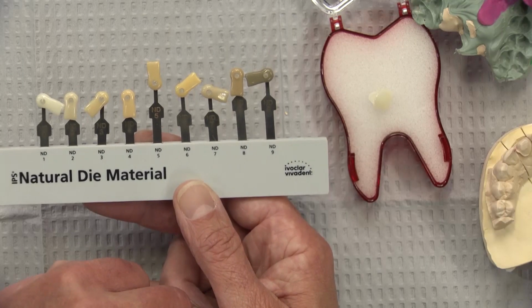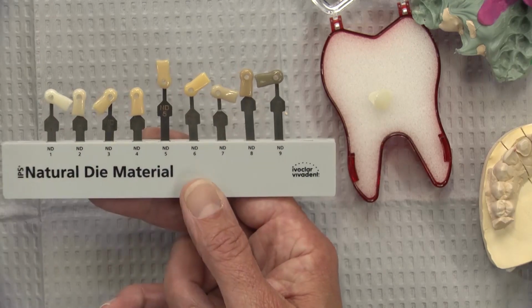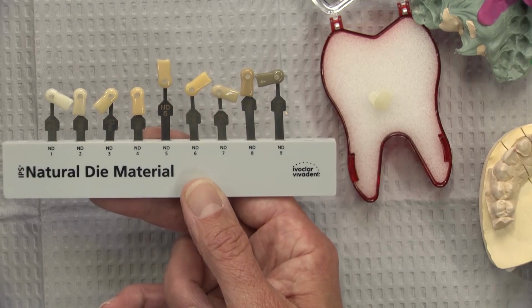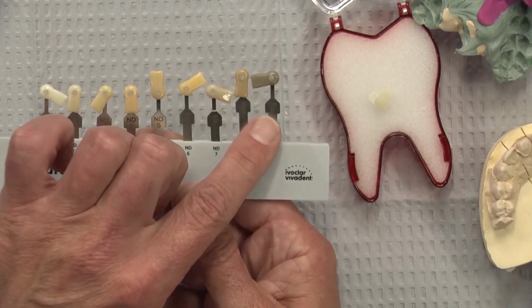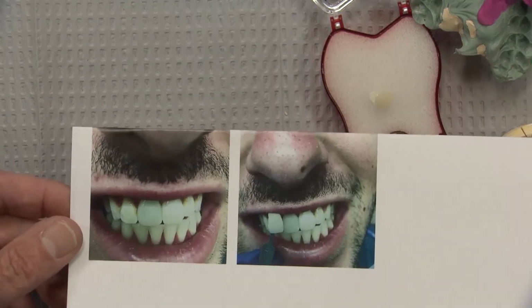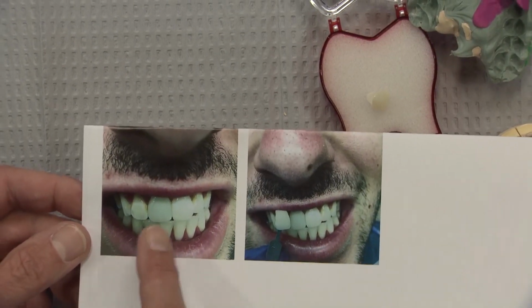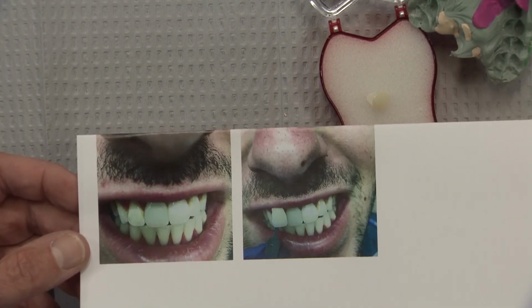We've actually made the doctor a regular BruxZir crown that we're going to send out now. So they're going to be able to place that on and not have to worry about this color influencing that final color like we saw happening here. It's clear as a bell to see that dark shade bleeding through there.